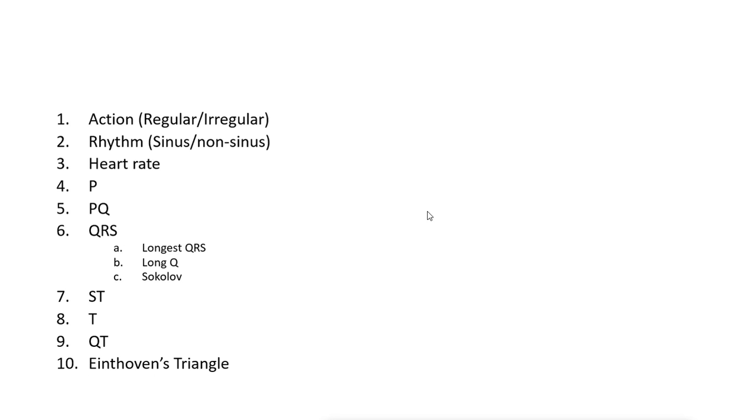Okay. So after you have gone through the sheet of paper, which includes the ECG description from the Department of Pathophysiology, and it explains point by point what is the physiological and what is the pathological value, that is what you need. So do that first.